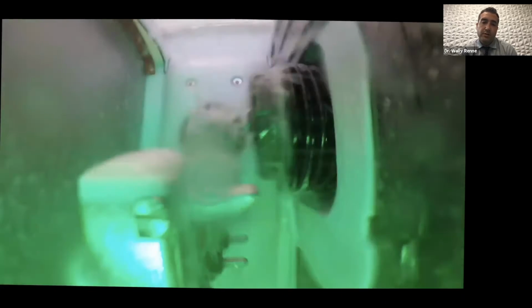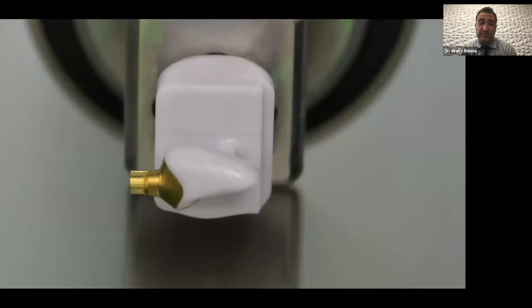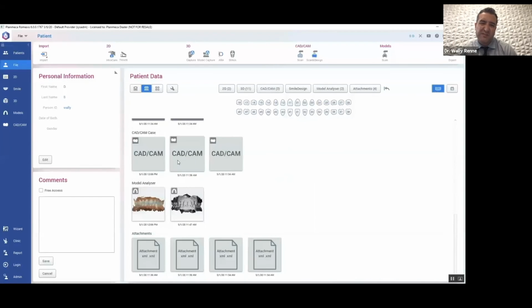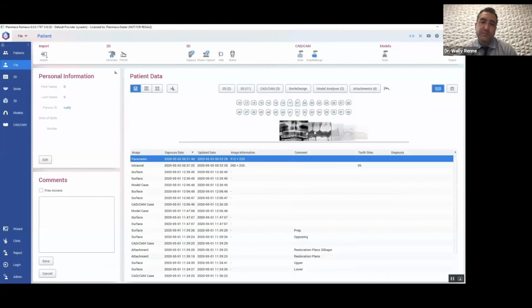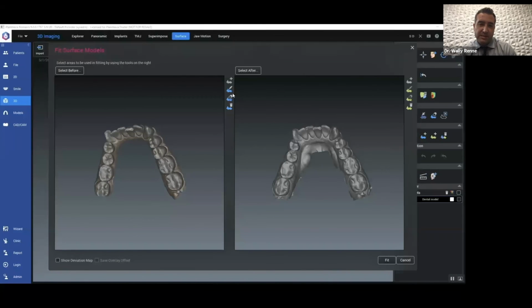at all. All you do is if you have a chairside mill, you could mill that restoration and make a screw-retained restoration on a custom titanium, in this case, gold anodized abutment. And the all-in cost for that is like $200 versus, you could imagine a custom abutment and crown from some labs is up there at $700, depends.